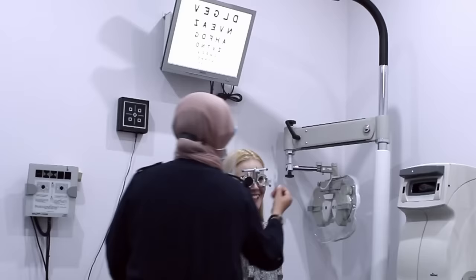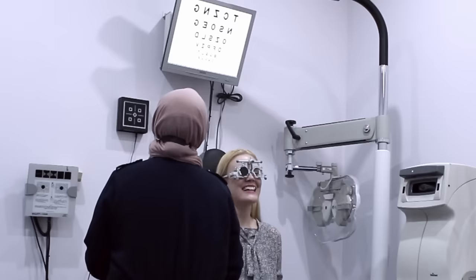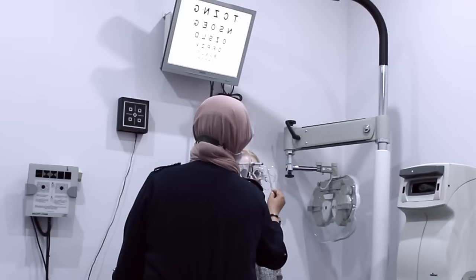If this again is your current prescription, okay? Oh. Can you still see that? Yeah, I can. Right, can you see the bottom now? G, L, T, G, E. What does that do, better or worse? Compared to that? I can't really tell the difference. Maybe it's slightly foggier? Slightly better without?